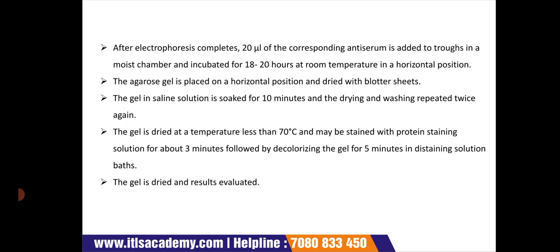After electrophoresis is completed, 20 microliters of the corresponding antiserum is added. You add the antiserum into the trough in the moist chamber and incubate it for 18 to 20 hours at room temperature in a horizontal position.